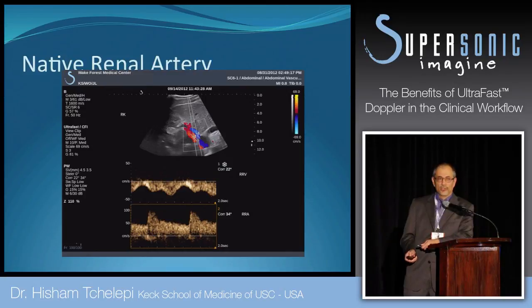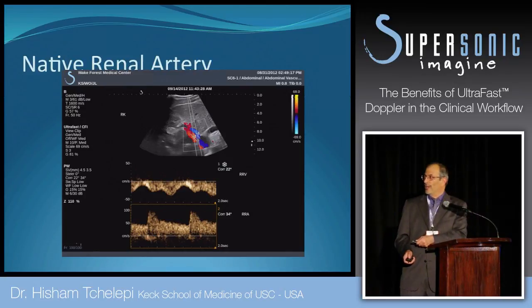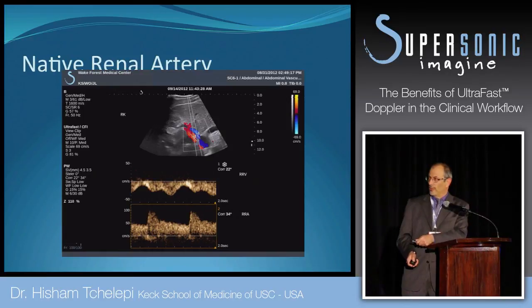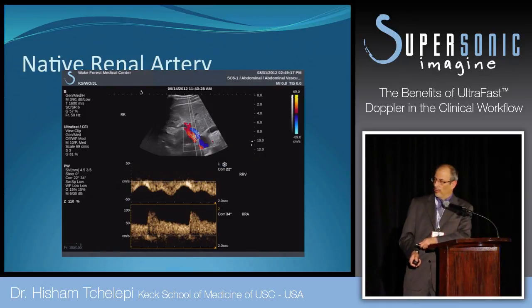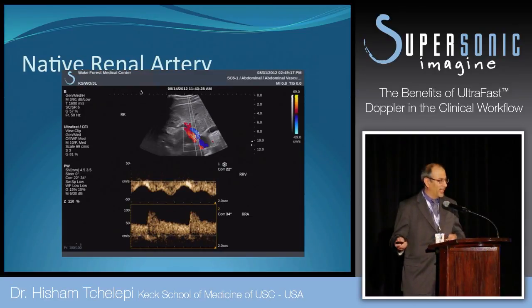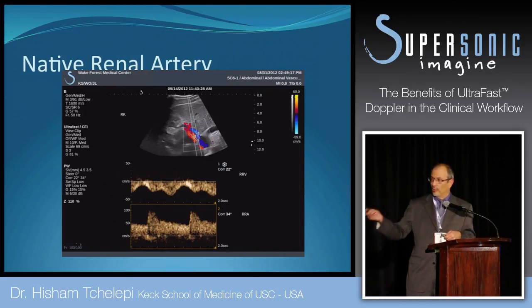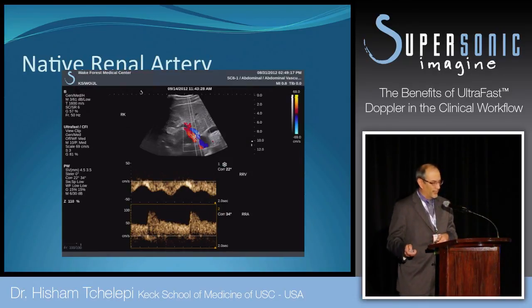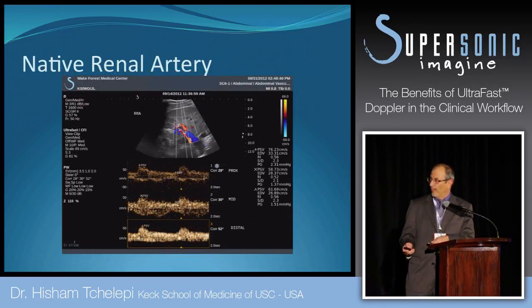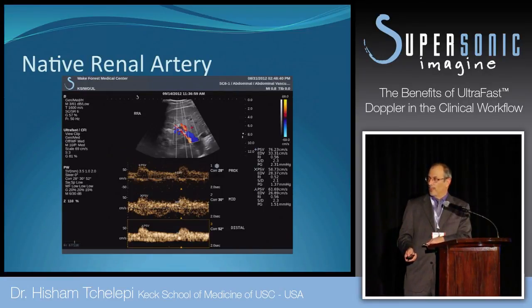This is a native renal artery study. In one beautiful sweep, you pick up information about the renal artery and vein simultaneously. You can see nice respiratory variability in the vein confirming patency, and a nice arterial waveform with the diastolic notch and early systolic peak — no evidence of hemodynamically significant stenosis. All done in one pass, one frame. If you don't like anything, you can move the cursor up and down within the acquired data. From the same dataset, we obtained other spectral wave Doppler waveforms, took measurements, resistive indices, and velocities to generate our report.